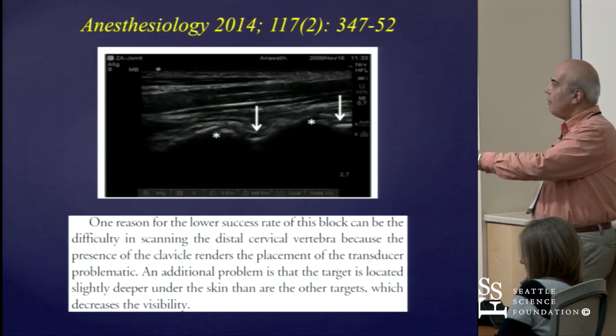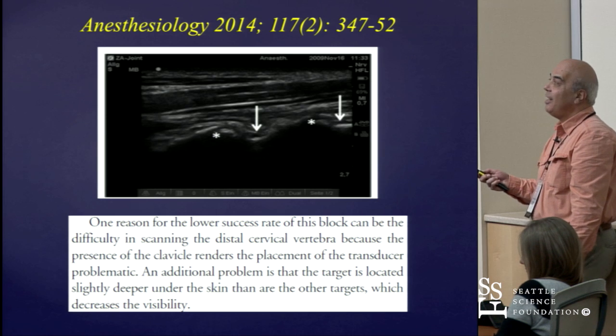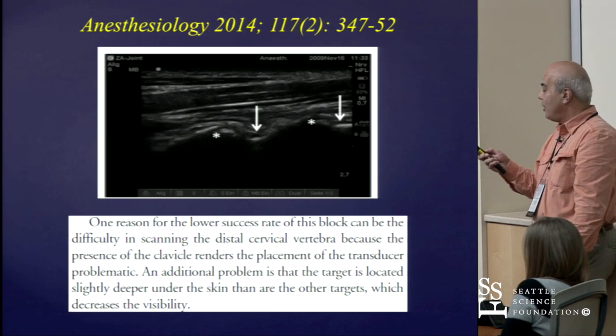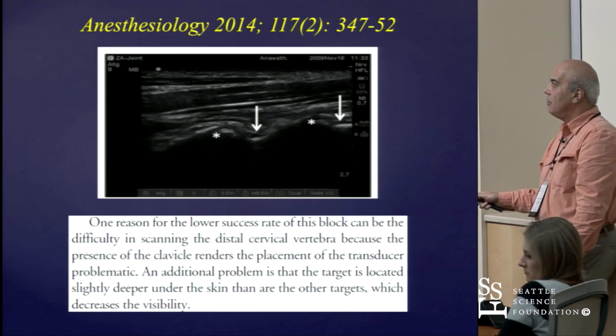Yes. I mean, you don't see the needle, but it looks as if you see the dot over there, and I would imagine that the needle would come out of plane over here rather than this way.